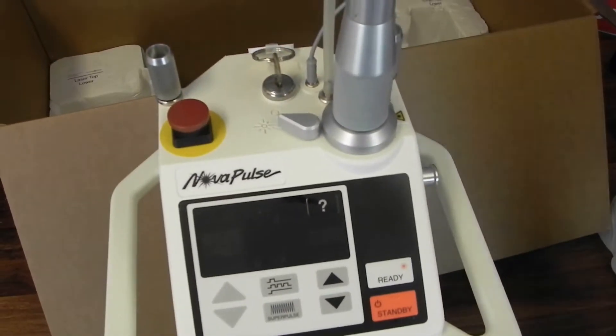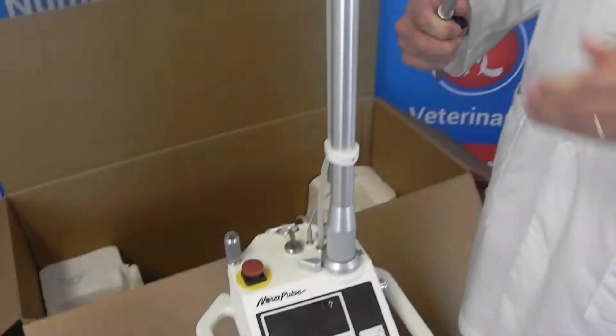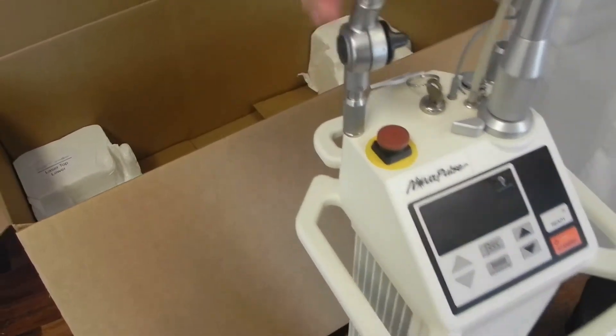You can also install the fiber support arm. Just loosen this, slide it into the slot, and tighten that back up. You can position that however you want.